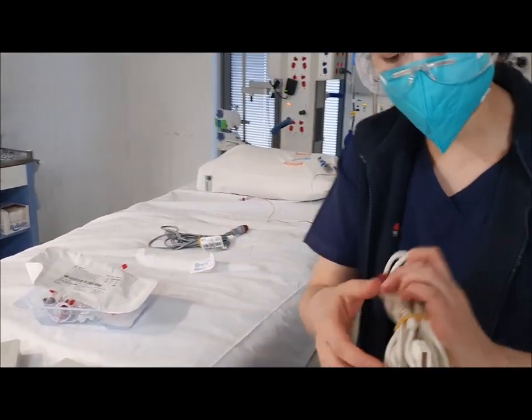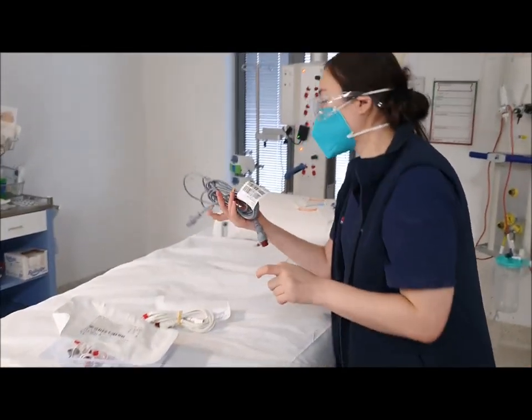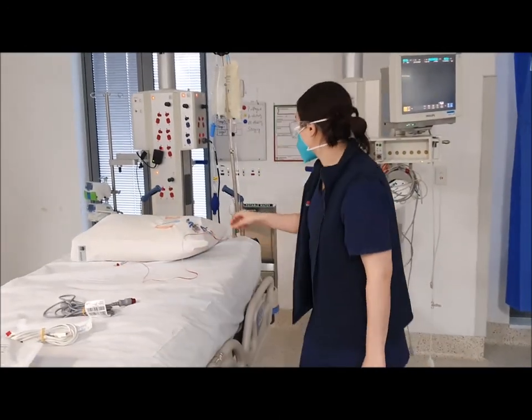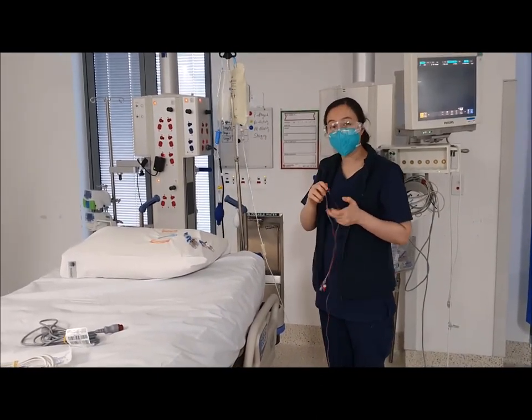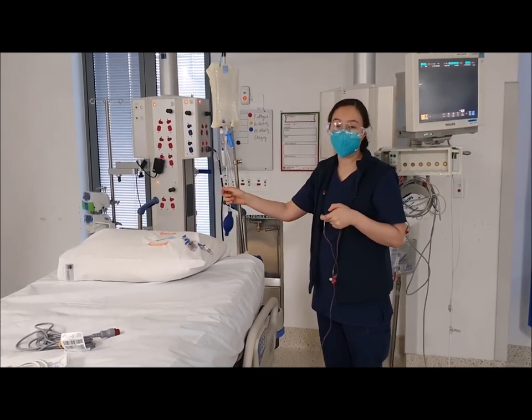You need a Pico pressure cable that has this end on it, and you need one standard pressure cable as well. You also need two pressure bags — one primed already because you're going to do central venous monitoring, and another pressure bag ready to go for your Pico monitoring kit.